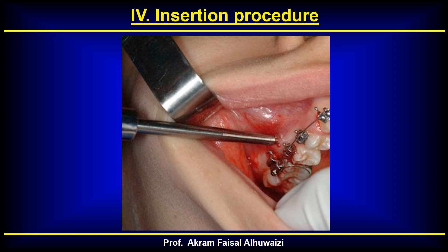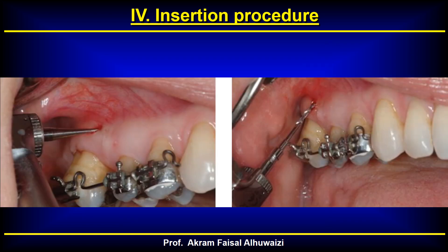Once the bone is engaged, change to the desired angle and continue drilling. Keep your hands steady during drilling to maintain a single, consistent insertion path. Continue until the collar touches the periosteum, at which point you will feel increased resistance. Do not further rotate the implant at this stage, as over-rotation makes it weaker, not stronger.